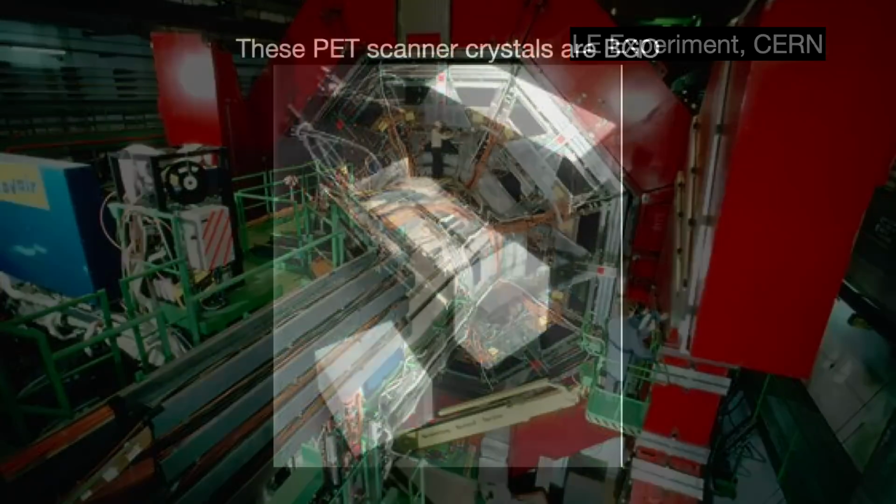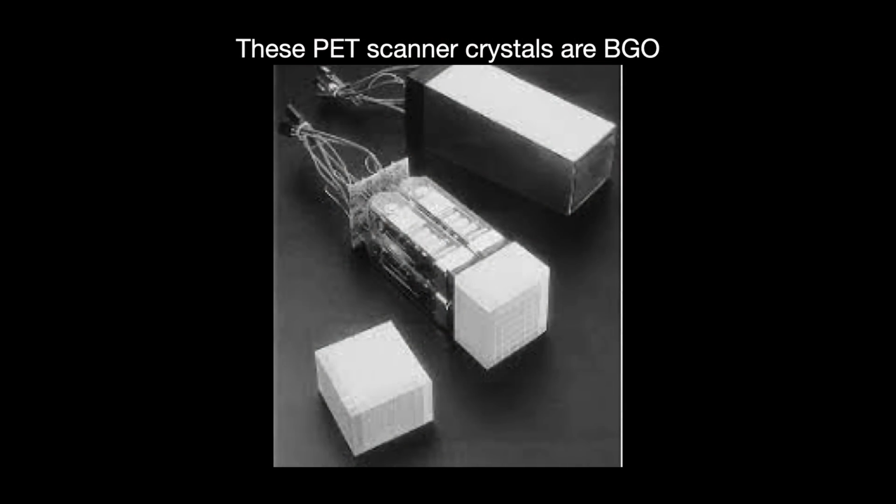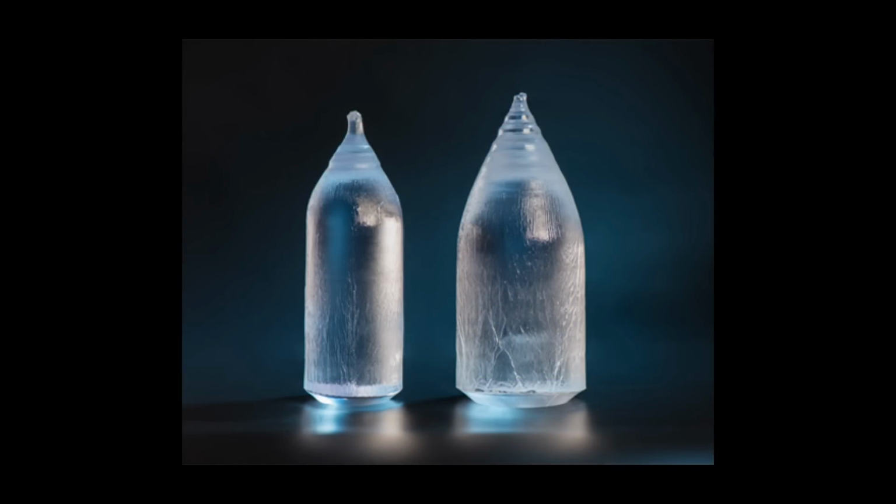Throughout the 1990s, BGO took over from the venerable sodium iodide to become the standard PET scanner scintillator crystal with some 50% market share. Up until now, scintillator crystals were discovered through pure dumb luck. But in the 1990s, people started using their knowledge of how scintillation actually works to guide their search. And in the 2000s, two new crystals emerged to make up for BGO's light yield shortcomings.